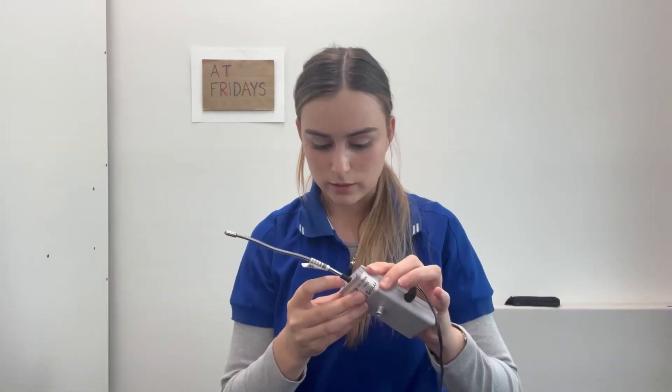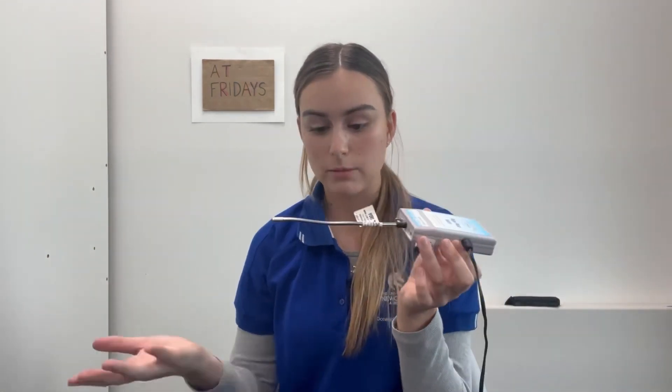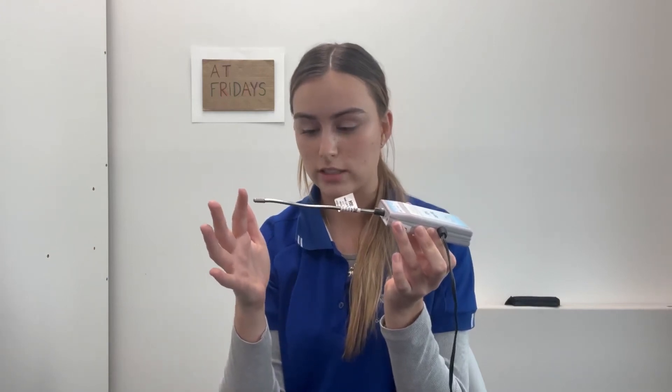It can be connected to anything that is switch adapted. The client that we used it for used it as a call device. I have here with me a switch adapted doorbell and a switch adapted door chime. I'll show you how it works. I plug the switch adapted doorbell into the Magic Wand Switch, and once it's on it will detect any movement that makes contact with the wand.